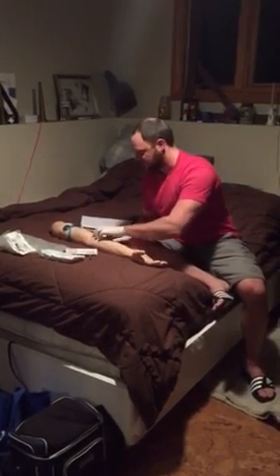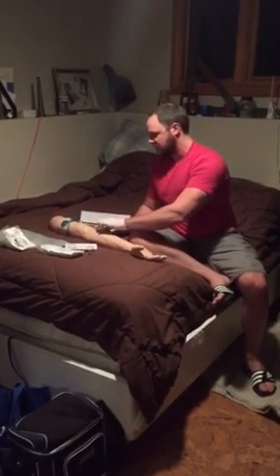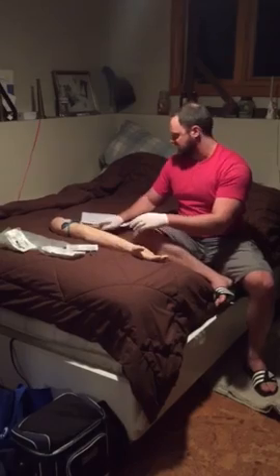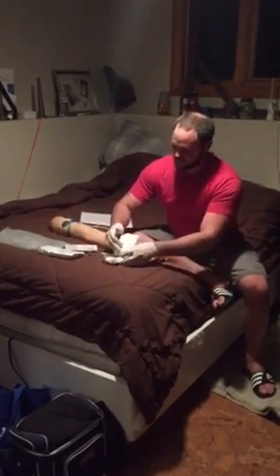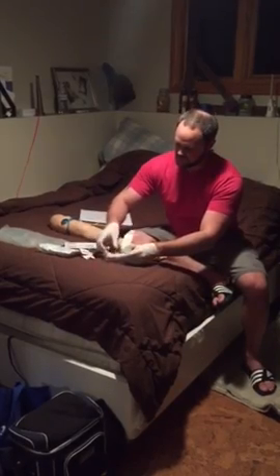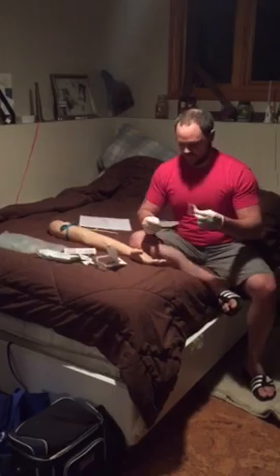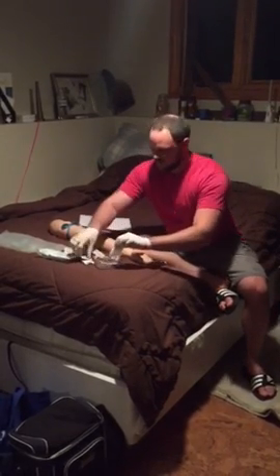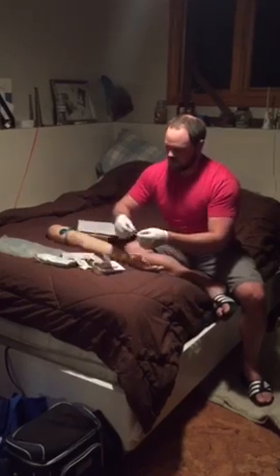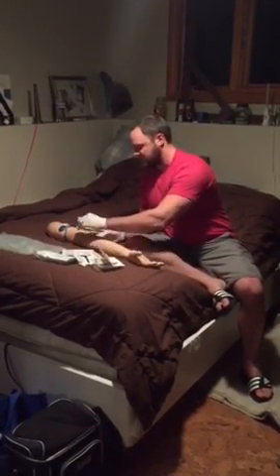We're going to palpate our veins. So since this is a dummy and it's all set up for us to have a nice stick, he's got nice good veins. Find the place we want to go. Go back into our start kit. This is your Tegaderm. It's just nice to kind of have it ready for you. And then we're going to get our alcohol prep pad, and we're going to cleanse the site.